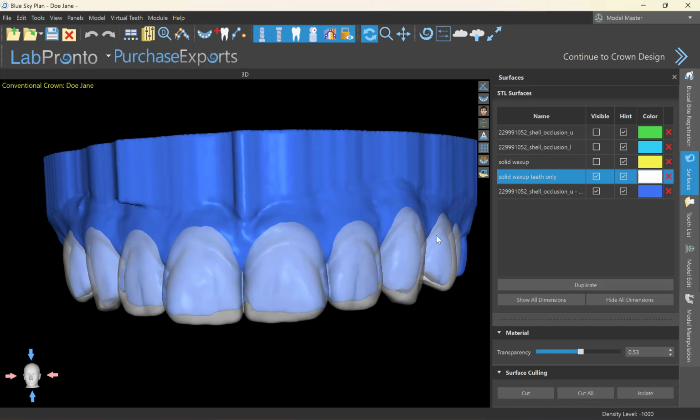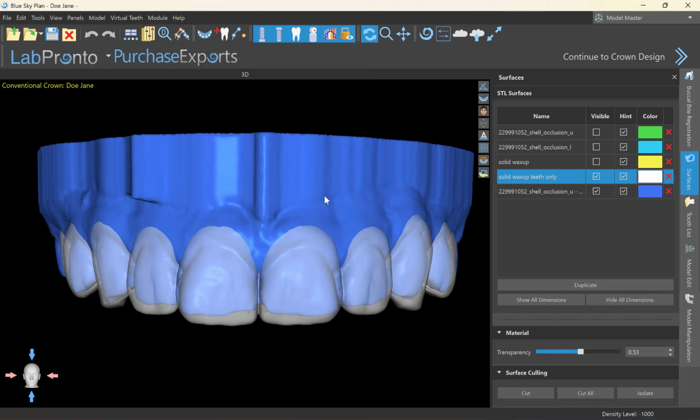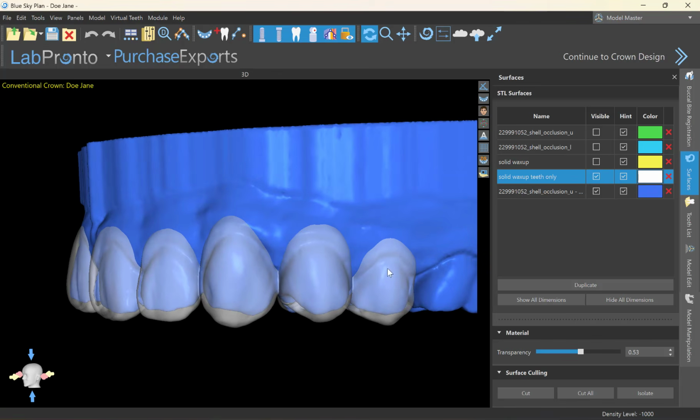And so after I trimmed the gingiva here, I would probably go ahead and lay a small flap and need to do some osseous recontouring. I would want that osseous margin 2.5 to 3 millimeters apical to the ideal gingival margin. Again, coming back to the idea of just using a simple Essix, we've accomplished the same thing. We can use the same guide for both because we're still going to see the ideal crown margin on the facial here. And now we just do osseous recontouring to 3 millimeters, let's say, apical to that same margin. So one guide accomplishing both things.